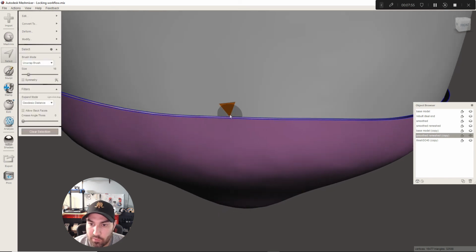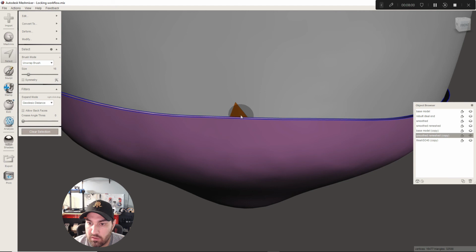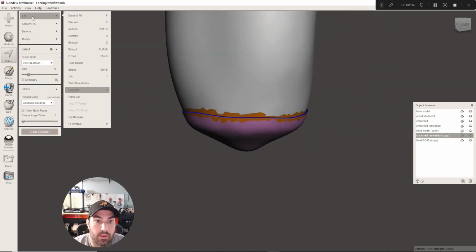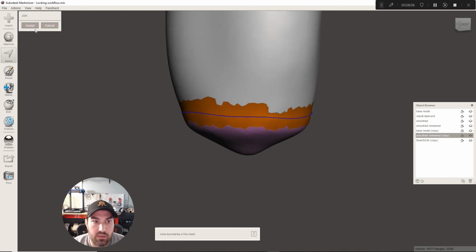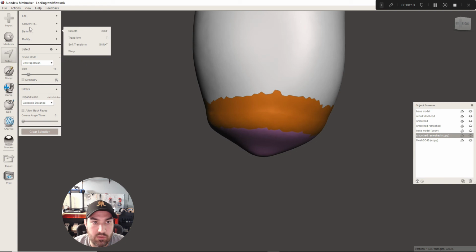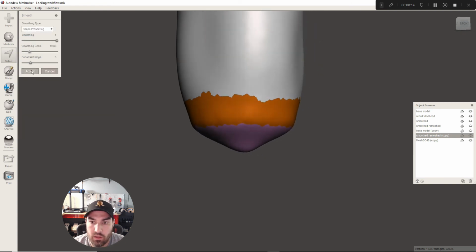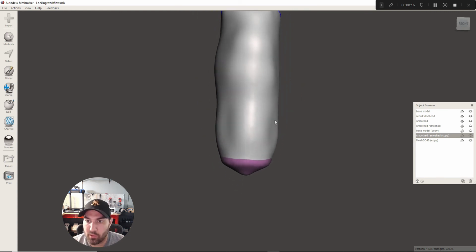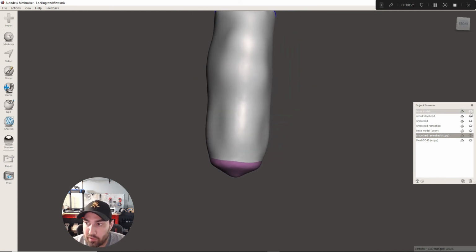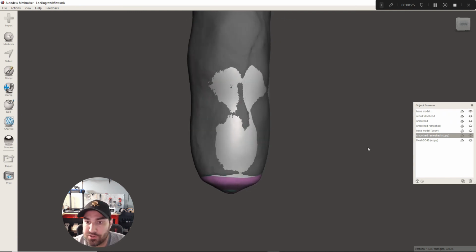This is just like when we rebuilt the AK the other day. Grab the 2, double click on 2 edge triangles and join that, accept, and then I'm just going to expand that out just a little bit and do a smooth there. All right, so that's our rebuilt model, now essentially 2% smaller than our base model, because we knew that after our modifications, we didn't really change much.